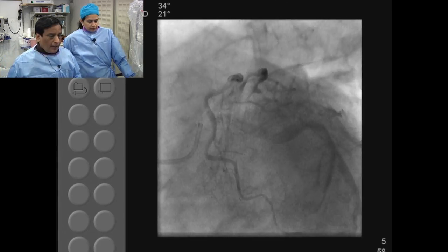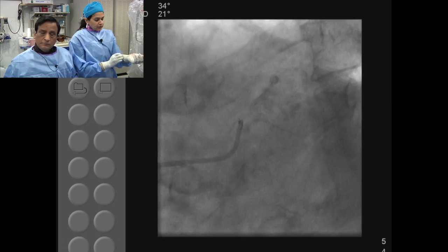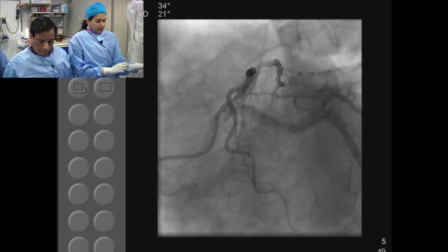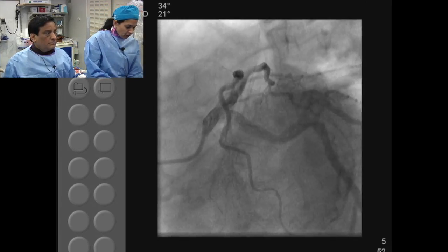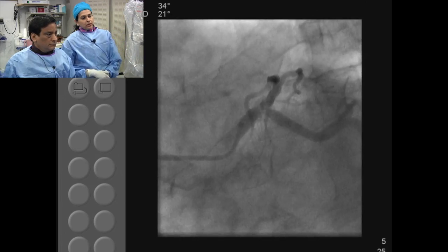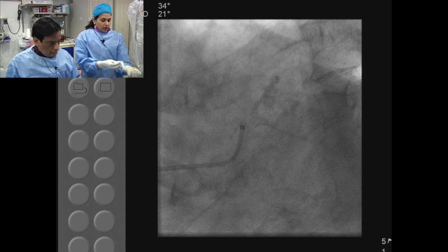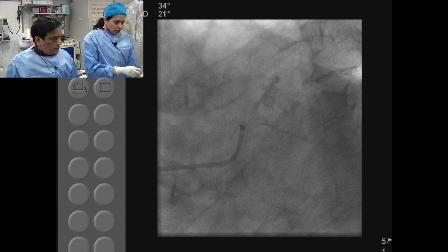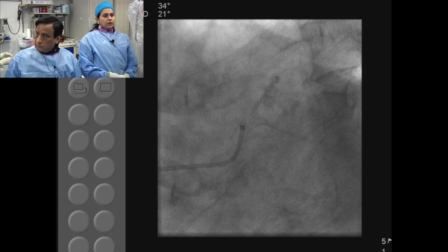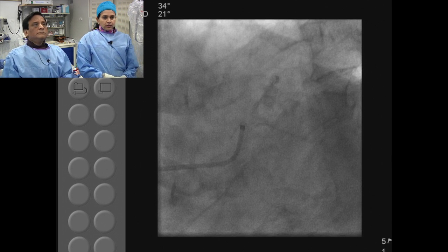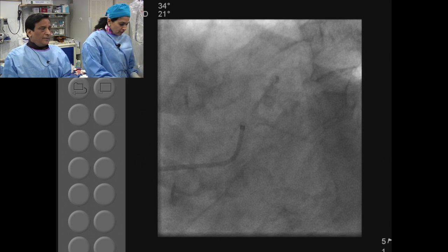What do you plan to do in this particular case? One thing you definitely need with this case — elderly patient doing rotational atherectomy of the left main — though her EKG is normal, you definitely need a temporary pacemaker. To understand the extent of the calcium, we have decided to do OCT. We will show it online — how to do the OCT, since we have this new acquisition which will show both the angiography as well as the OCT being done at the same time. The question is: do you need to do it in both limbs, or does just one limb suffice?